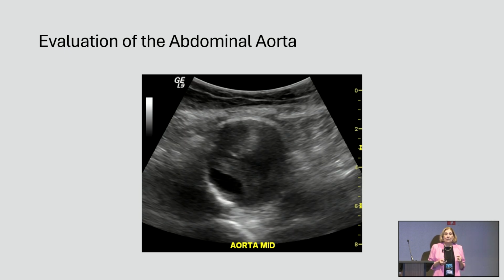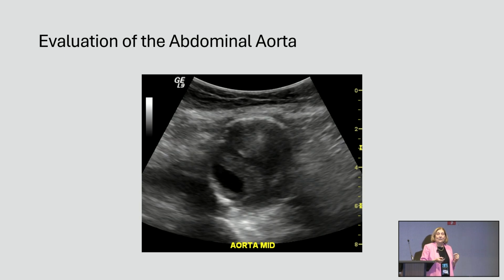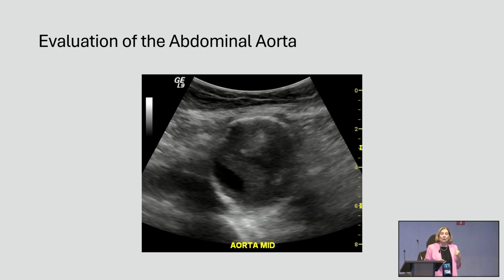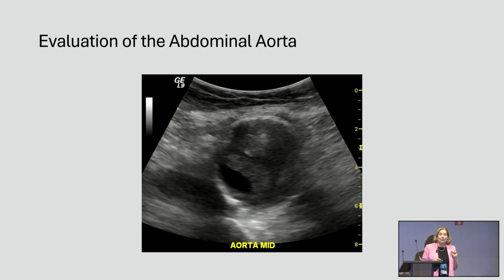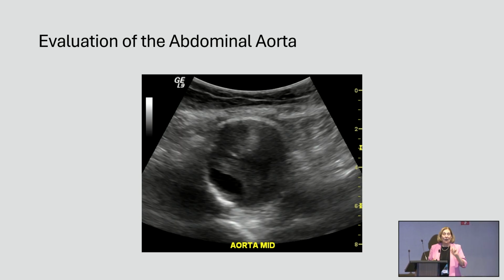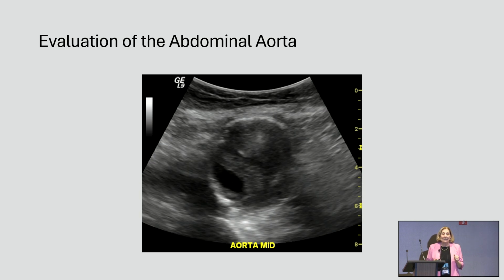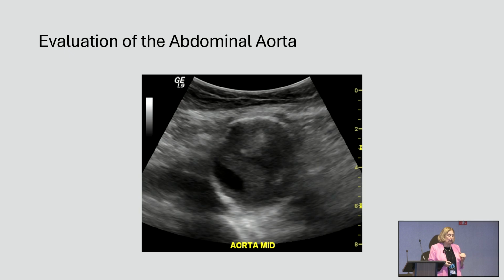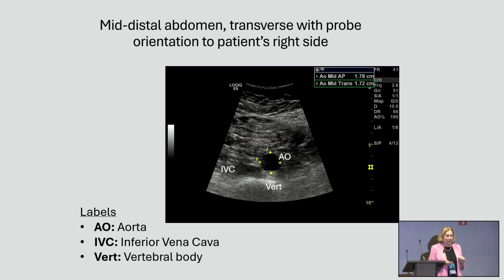We're always tempted to measure the residual lumen in all of these, and I think Dr. LeSar is looking down, but I'm going to ask him to look up. Do you need to know the residual lumen on this? Would you want to know the residual lumen? Yes. Not all physicians do, some say I don't care. But I care, and I'm going to give it to them anyway, though you really want to make sure you get a good outer to outer. Sorry to throw you up there, Chris.